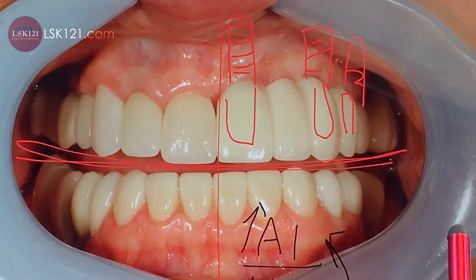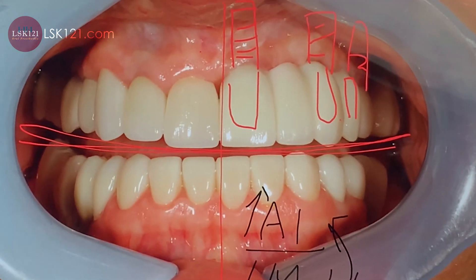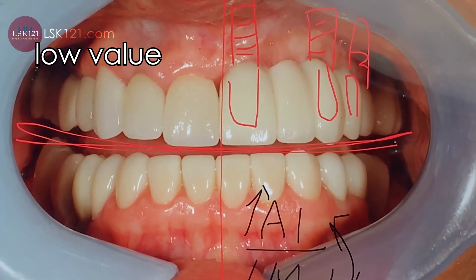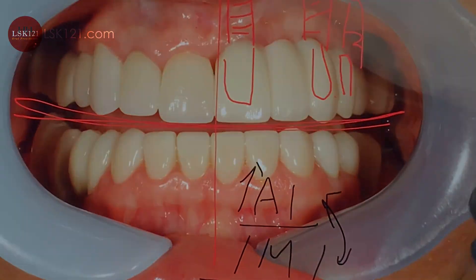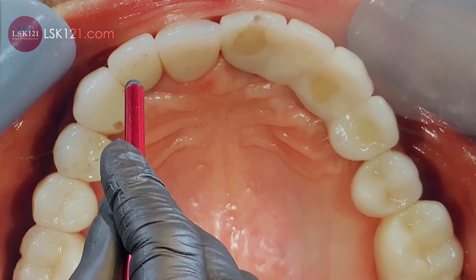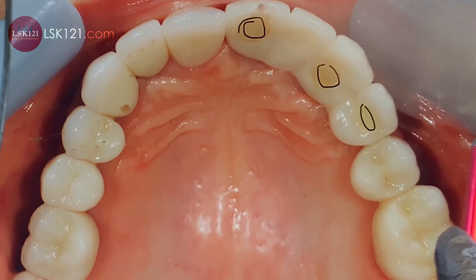Looking at the upper, it has a low value — a lot of enamel — which is not matching. The upper and lower need to coordinate. The occlusion view shows the temporary is really good; you can see the screw access hole. The lip support looks really good, but there is a discrepancy.